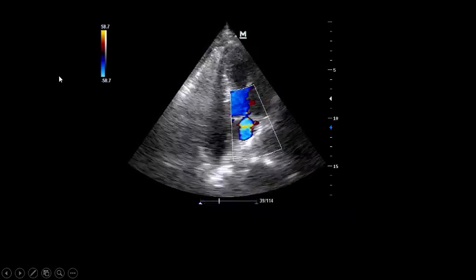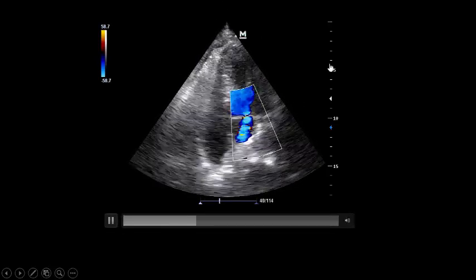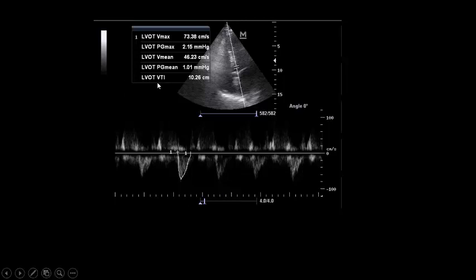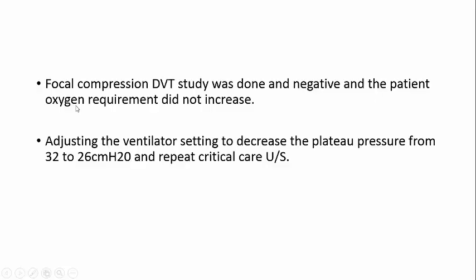Looking at other views: the mitral regurgitation is still visible, but the right side is ballooning and compressing the left side with no new wall motion abnormality on the left side. In any high-risk patient, check the LVOT VTI because you need to see if this acute cor pulmonale is compromising stroke volume. The LVOT VTI is very bad at 10 — normal is 18–22. We then did a focused compression DVT study because we feared showering of pulmonary emboli. This was negative.